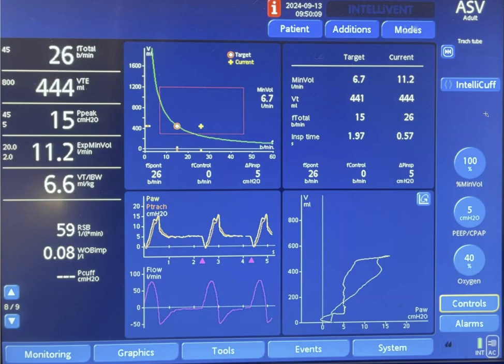In other words we do not know exactly how much does he need. Once we set it up and he decides that this is 11.5. So this is almost 1.8 or 180 percent of the minute ventilation that we're setting him on. So that's number one.